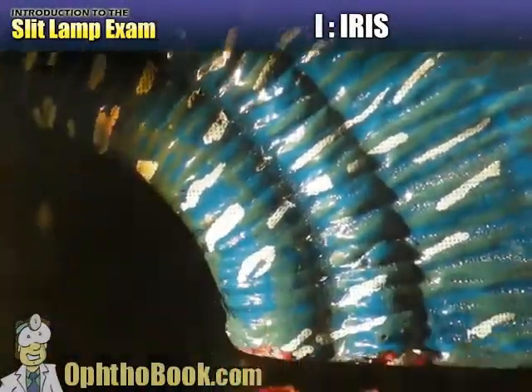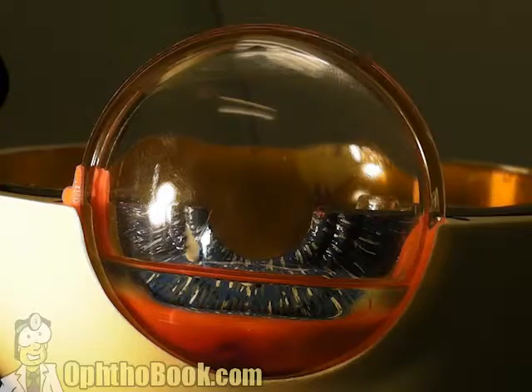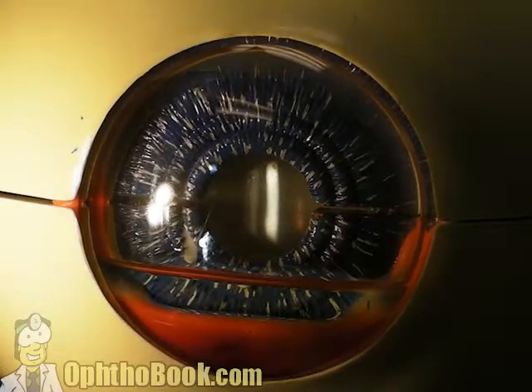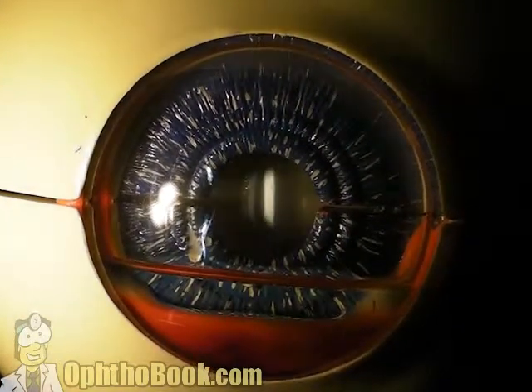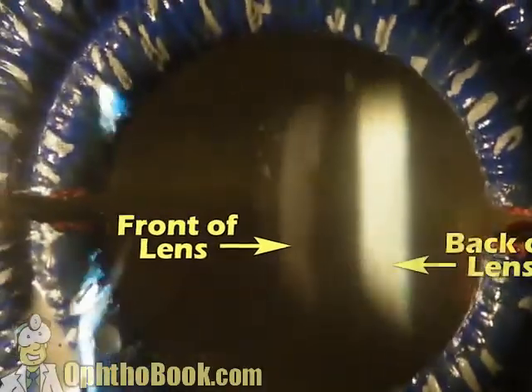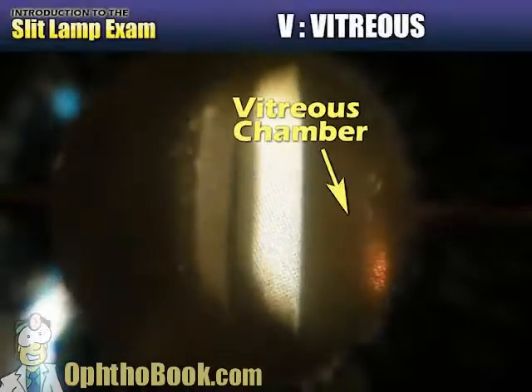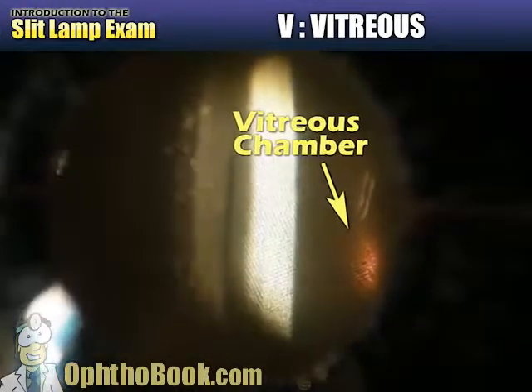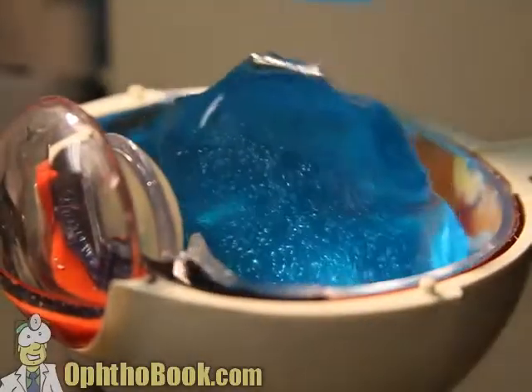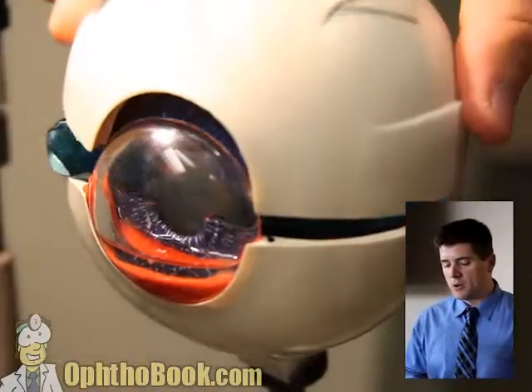Moving on to the iris — by far the easiest part of the eye to look at because it's flat and always in focus, and there's usually not much pathology. Behind the iris is the lens, which you can only see by looking through the pupil. The lens is another clear structure, so we use our cross-sectional beam to look at it the same way — you can see the front of the lens, the back of the lens, and the lens nucleus in between, where people mostly develop cataracts. Behind the lens is the vitreous cavity, which mostly looks dark because it's optically empty.